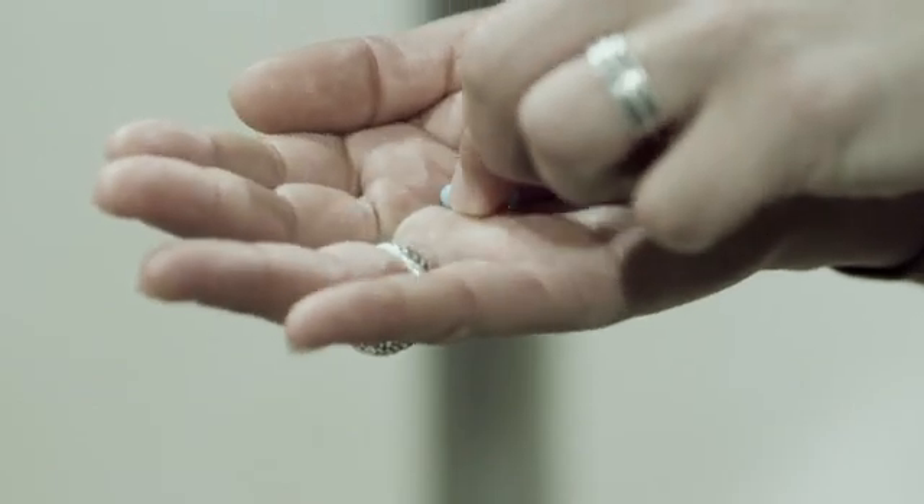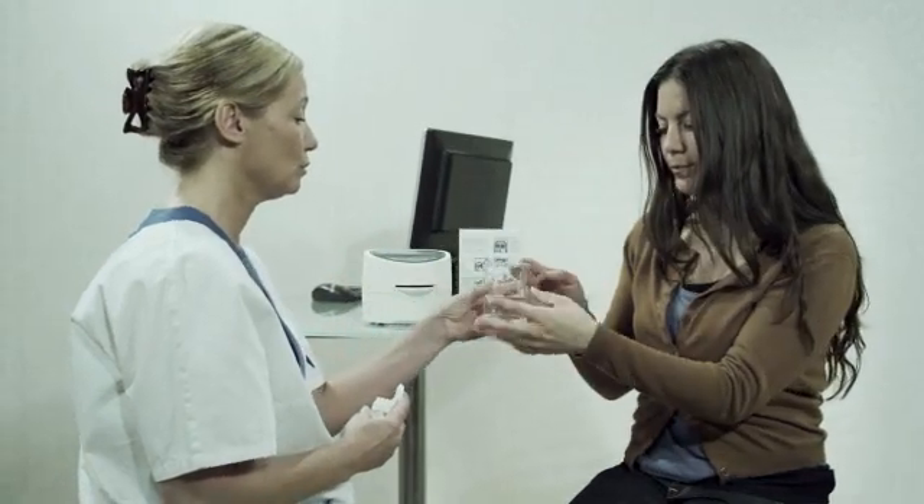Ask your patient to swallow one HeliCap together with some water. Then wait 10 minutes.